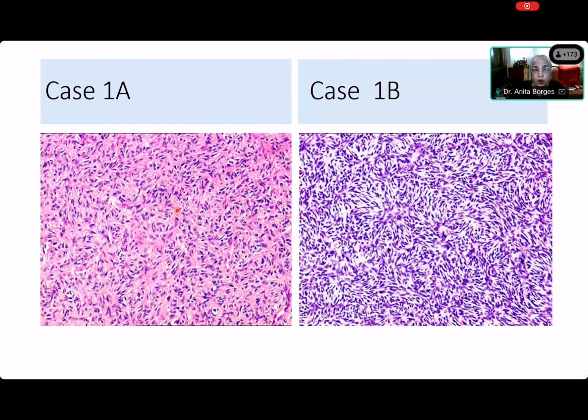But every single one shows you a point, and you can see the point. Let us see if I can get some points to come up over there. I'm going to mark the points from which all this storiform is coming up. Okay, there is the point.